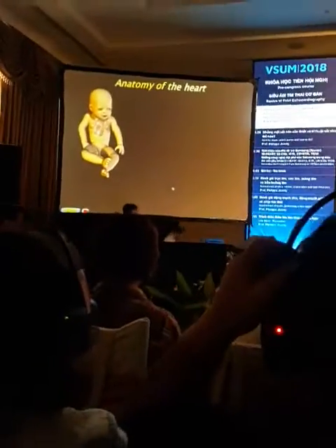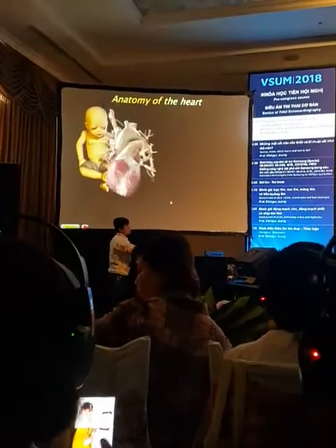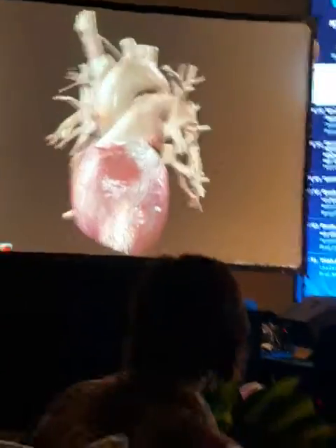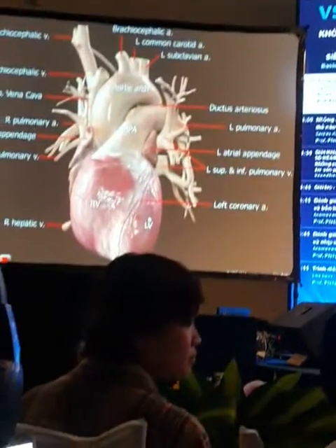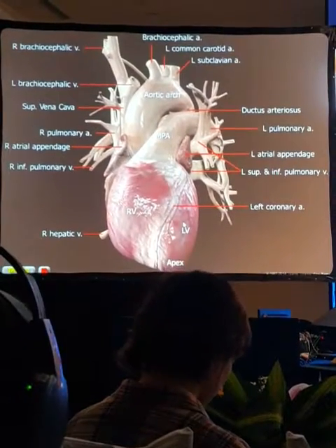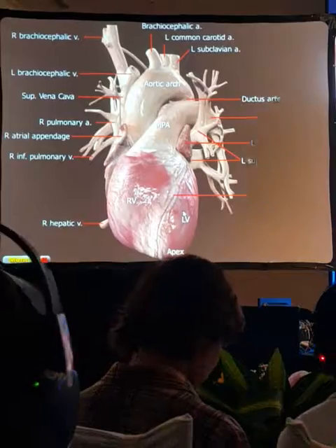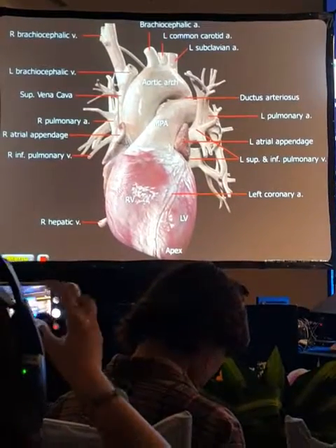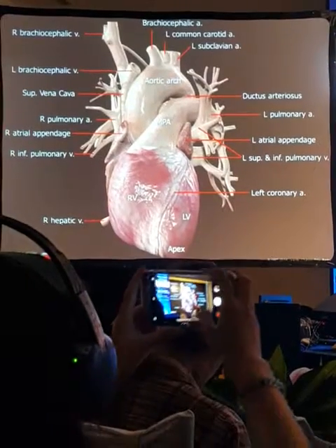With the baby in frontal position, we're going to turn around the heart and then look at the important landmarks. If you want your baby to be comfortable sitting over there, because it's not comfortable for you to be, okay? So, the first thing to see is that the right ventricle is the most anterior chamber.